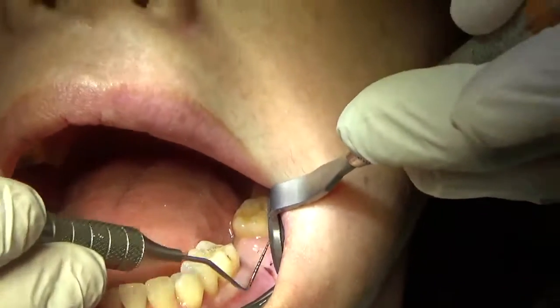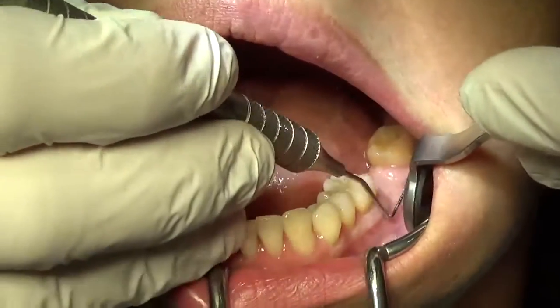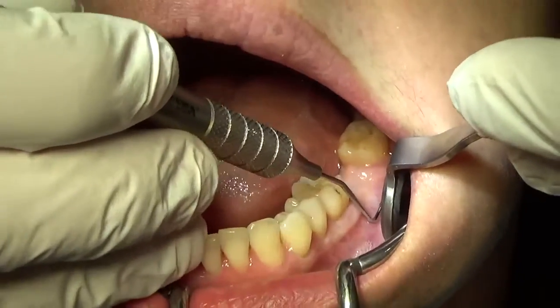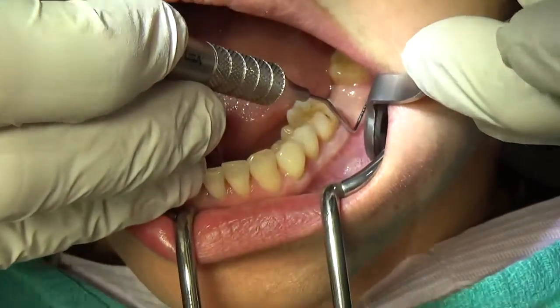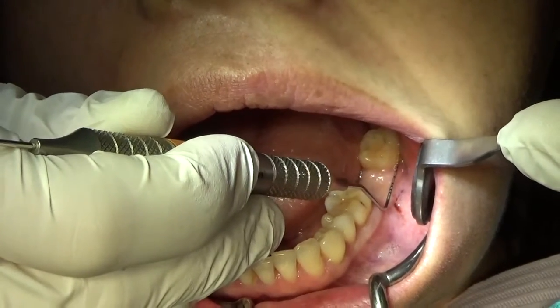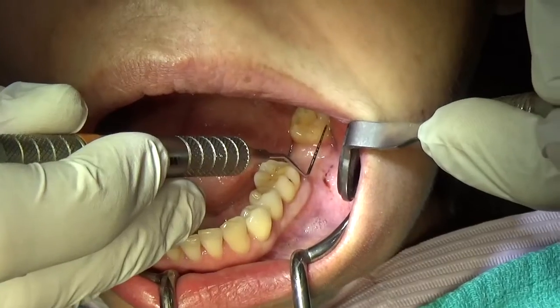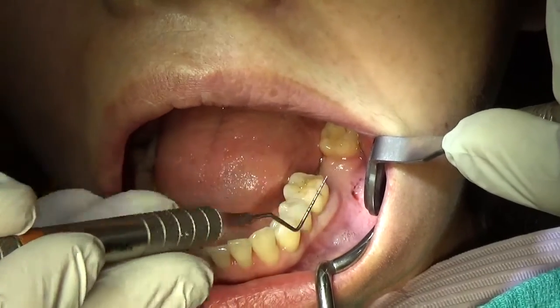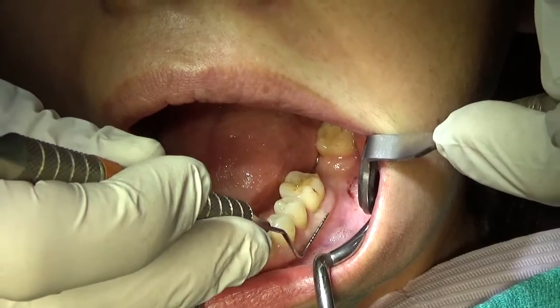If we look back here, you can really appreciate that defect if we come in from the occlusal, Dr. Sanchez. You can see that there's space if I put my probe right at the adjacent. Can you all see the space right there? And another big thing that I'm looking at is the keratinized gingiva that's around. We can see this really nice band of keratinized gingiva that she has on the adjacent teeth.